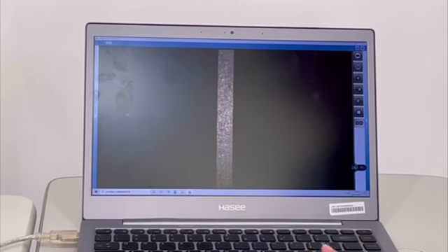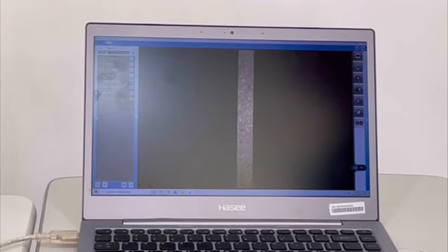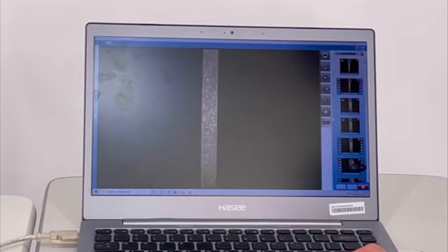On both sides, left and right, there is an invisible window. You just click this triangle to expand it or hide it. On the left, there are the patient names for the different files. On the right, there are the pictures and videos that you already took.